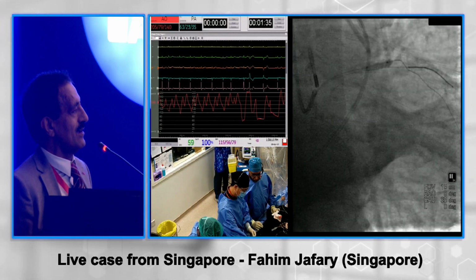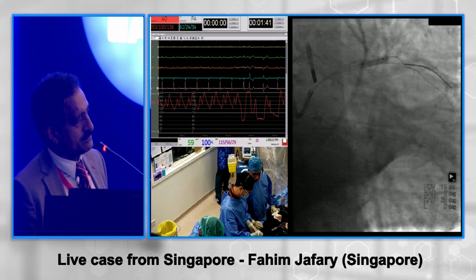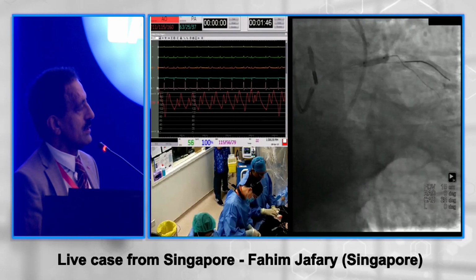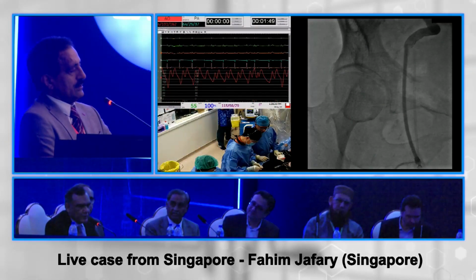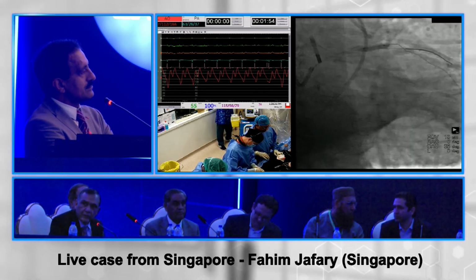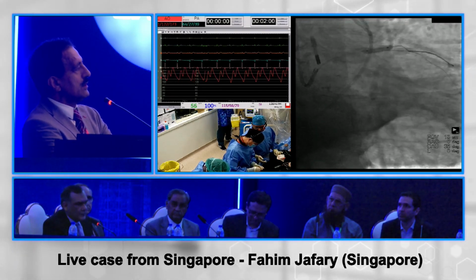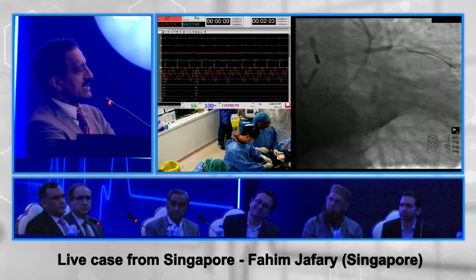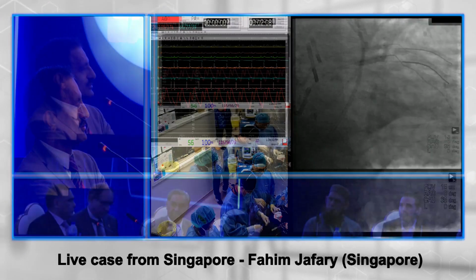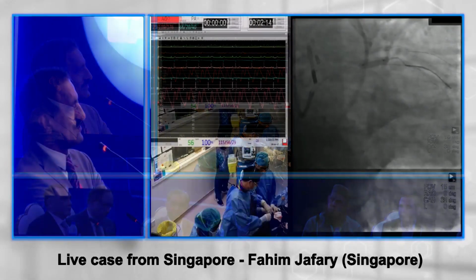Yeah, I think I would use OPN. I've probably had more than 90% success at 34, above 35 atmosphere. I think it will open up usually. But I wouldn't use a 1-to-1 size balloon. I think if you have a lumen diameter above a certain area, then stenting would be fine. So I think OPN of 3, even if it opens up completely, would be fine. The last 2 OPNs I have used, as soon as I went above 35, both of them ruptured. I know people have gone up to 40 also, but I don't know others' experience, but the last 2 of mine ruptured at 35.